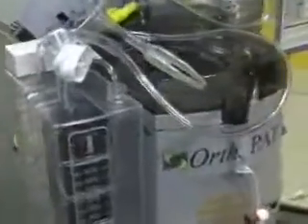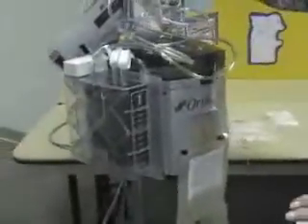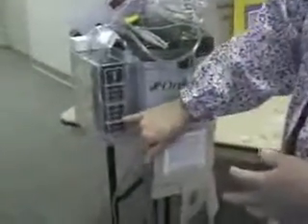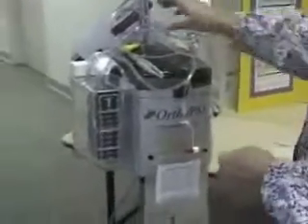Correct. Now, is there a section in here for where it's collecting? Because the gravity, it seems like it would be going uphill. The machine does that processing. We don't actually hook it to any kind of suction. In surgery, they might. That's why we have this little suction head here. We don't put it to any suction. The machine pulls it. As it's processing, the machine pulls it. Because it must be plugged in. Right, it has to be plugged in. As it reaches a certain level, then it'll bring that blood up and rinse and spin it and go into this little bag.